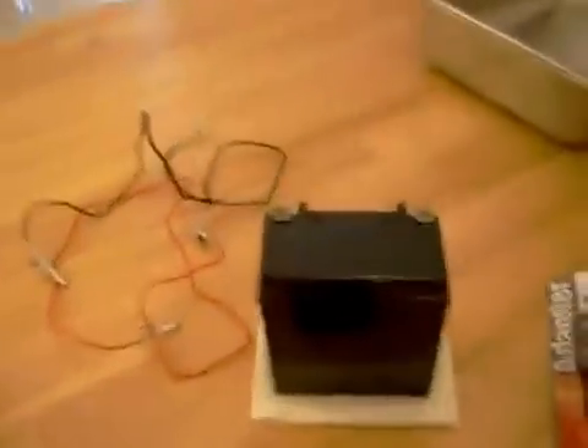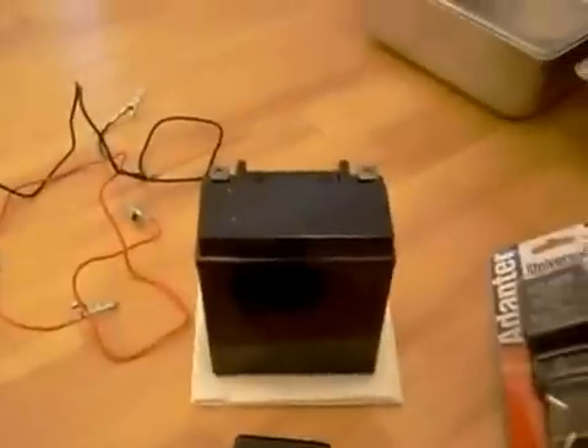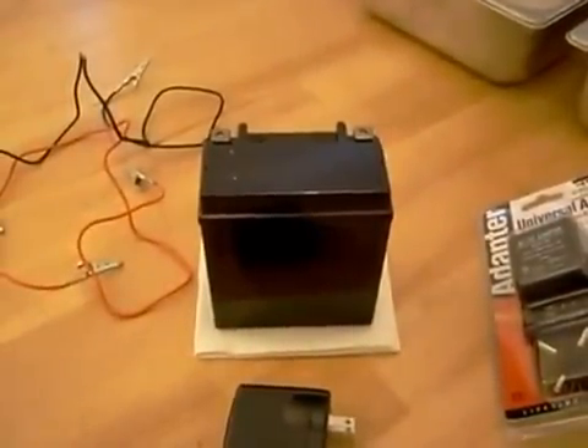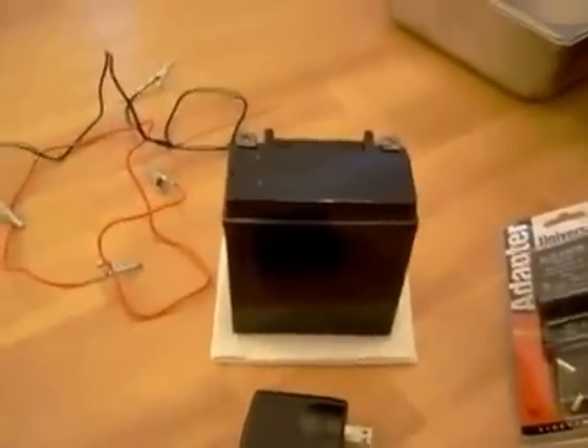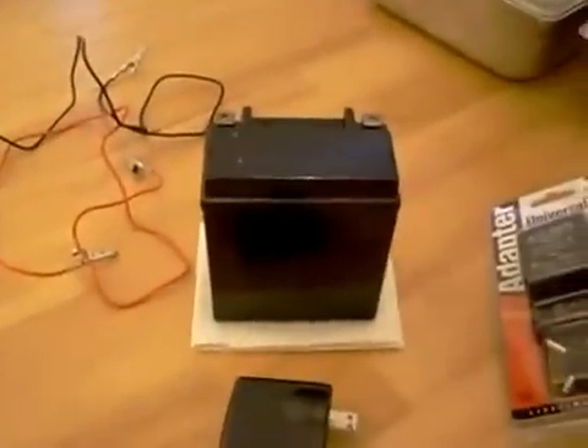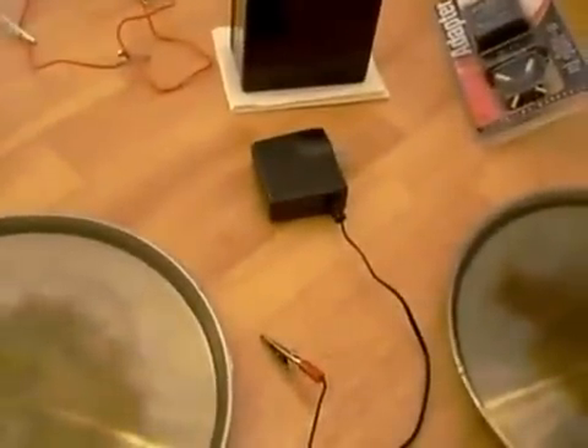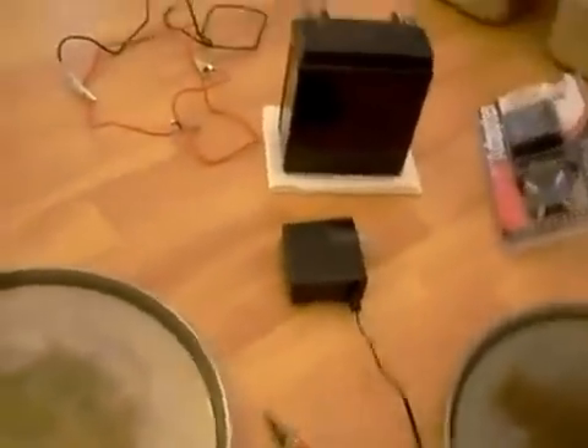If you want to be on the safe side, just get a couple of batteries. You could even get 6-volt batteries and put them in series to get 6, 12, 18, or 24 volts. I've also used two of these batteries in series to get 24 volts. But this transformer is what I found to be the best for me — cost about 10 bucks, pick it up on the internet. Just look for a 120 to 24-volt DC conversion.